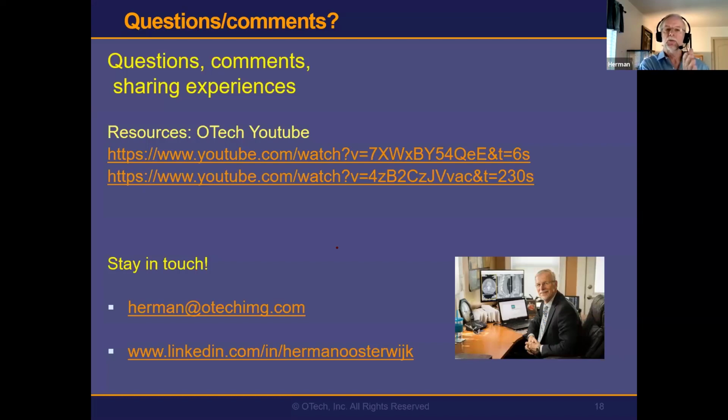Well, the imaging order form is more specific, right? So you could have specific information added to the OMI that is not in the ORM. Now, that information from the OMI could be put in the ORM, but it's not always as obvious where it is. I haven't seen a lot of OMIs, but I would recommend it for sure, because the more specific you are, the better off you are. But you could do your job with the ORM as well as with the OMI. And also, OMIs are not necessarily supported. Actually, I have not seen a lot of systems that support OMI. This is not a bad deal.